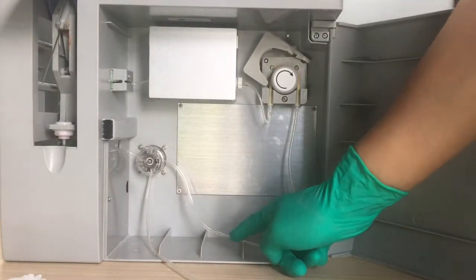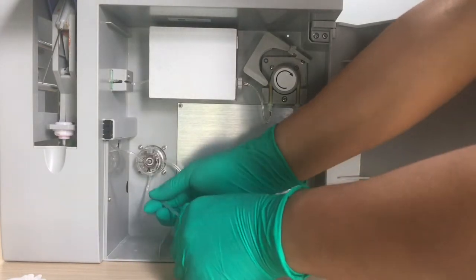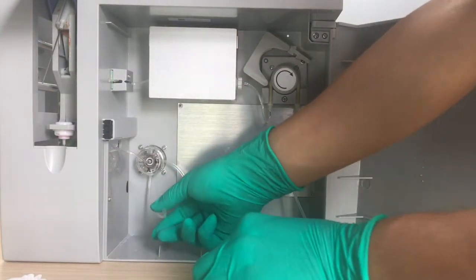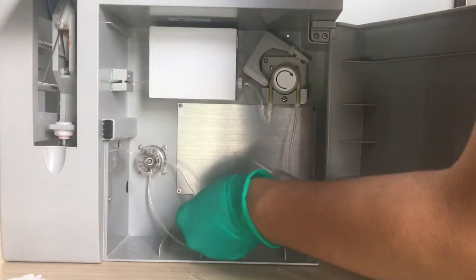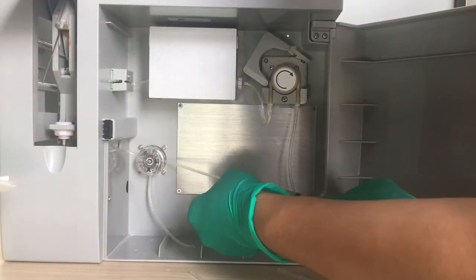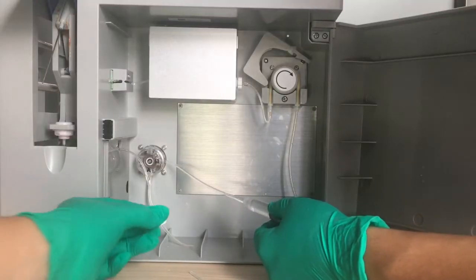Now we take off the hard tube and connect the tube with the syringe. We connect the B channel first.